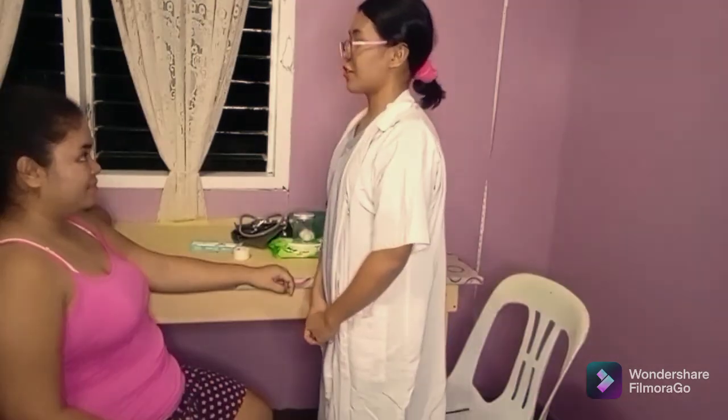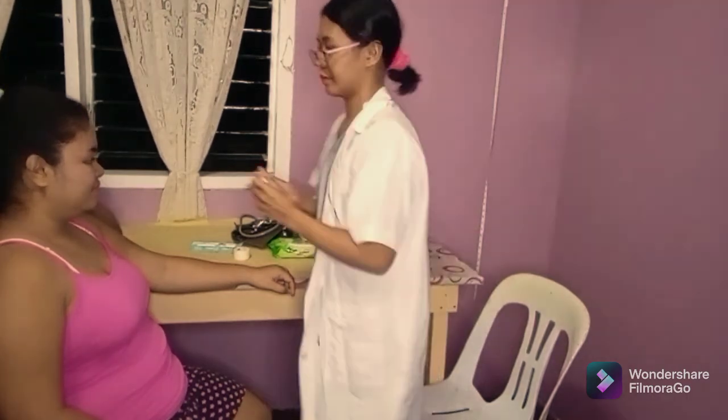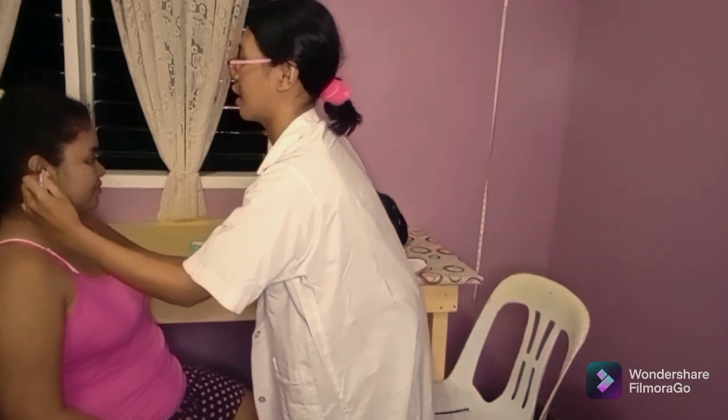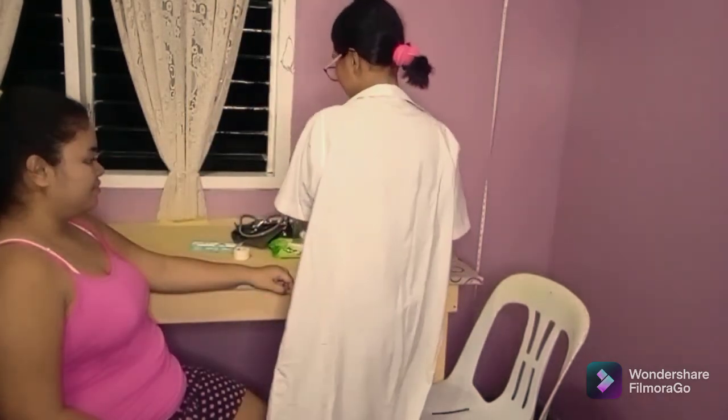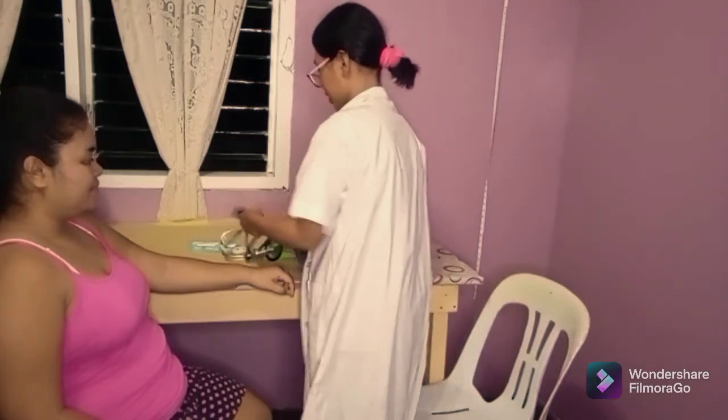Okay. The first thing that we need to do is take your vital signs, ma'am. Simultaneously, I will take the vital signs, including the BP, the temperature, your pulse rate, as well as the respiratory rate. So first, let me take your temperature. Okay, so your temperature is 37 degrees Celsius. And now, let me take your blood pressure.